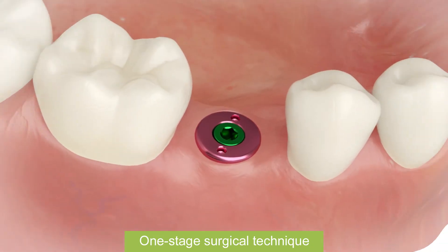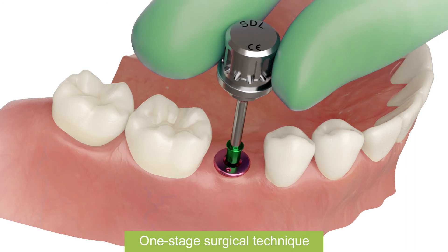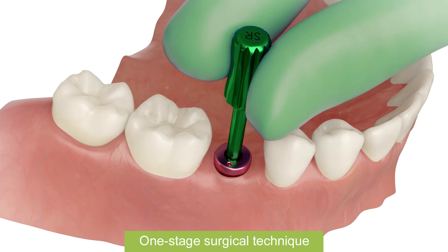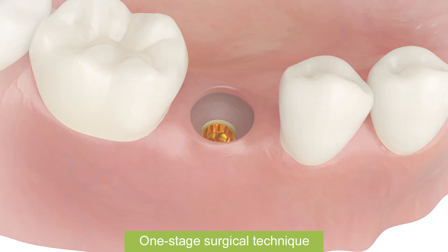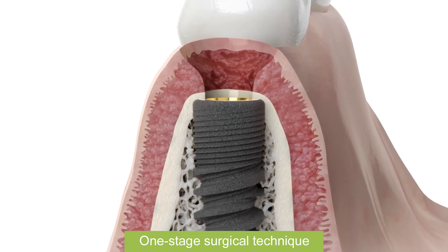After healing period, remove healing abutment from implant. Use abutment extractor for easier removing. Gingiva healed and formed.